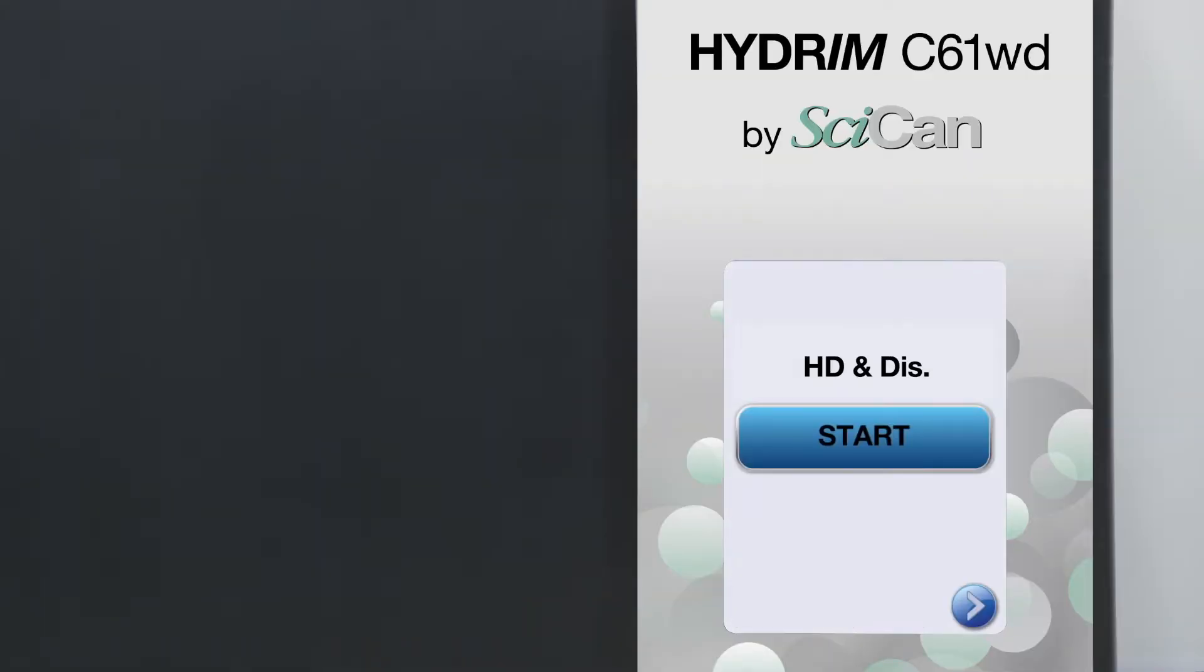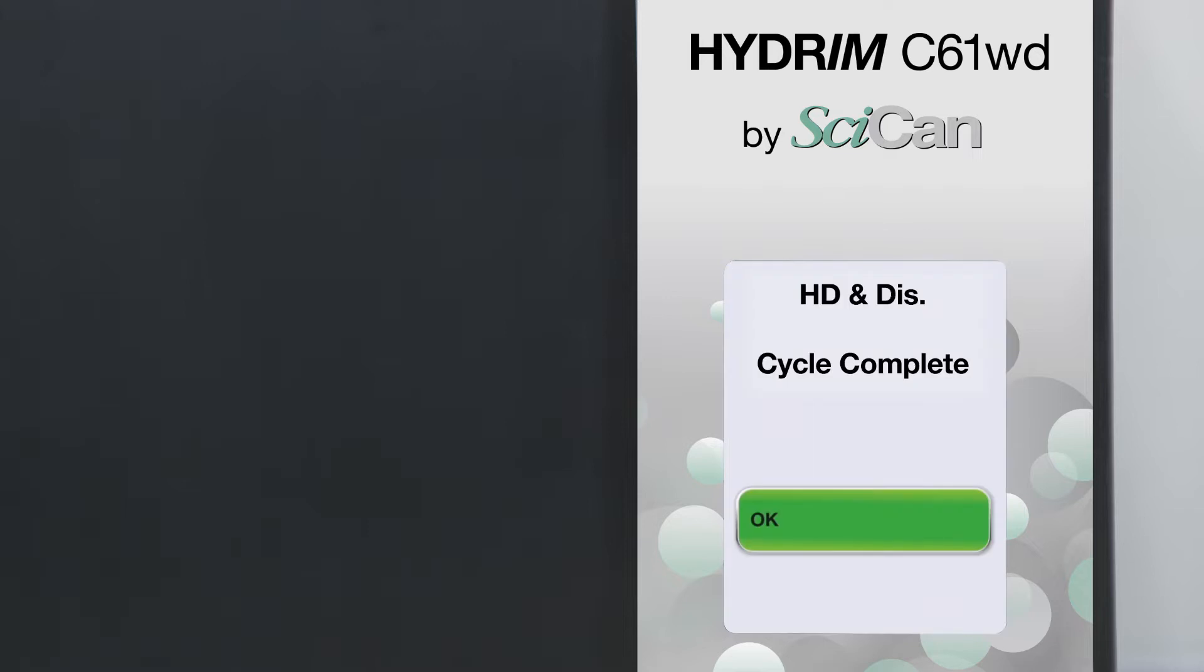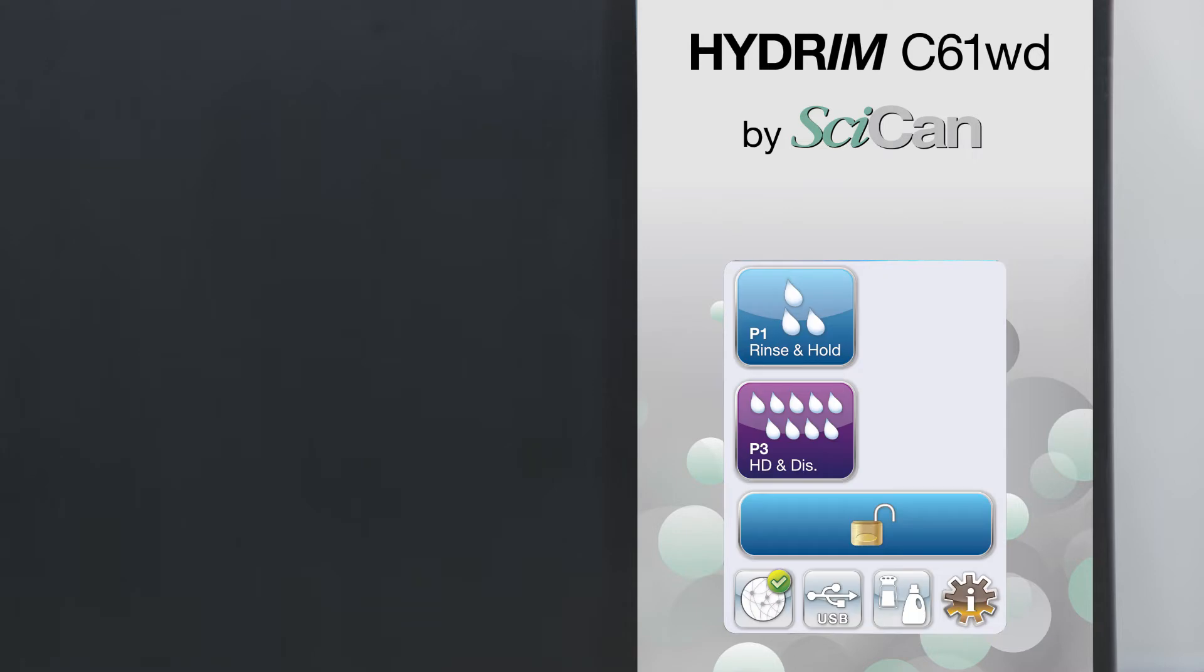Press the start button to start the cycle. You will see the time it will take to finish the cleaning process. Once the cycle is complete, press OK to release the door.